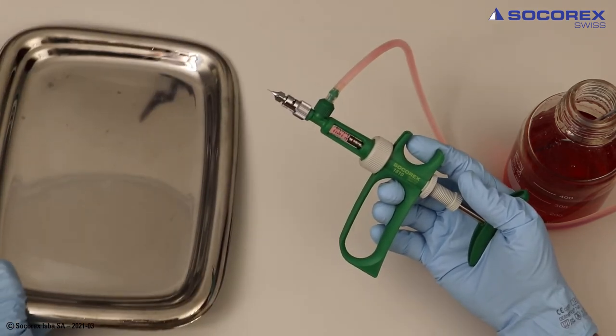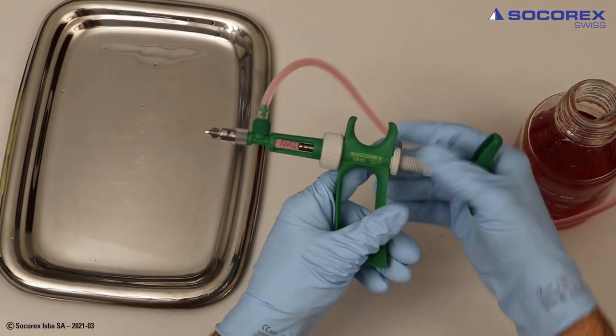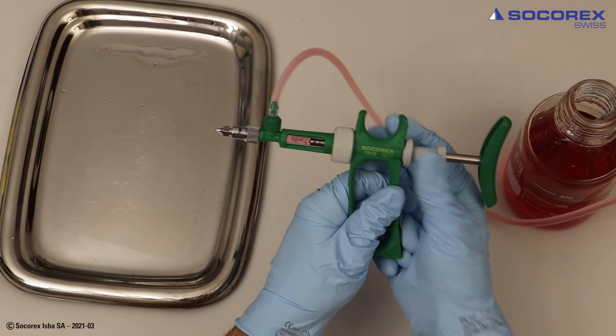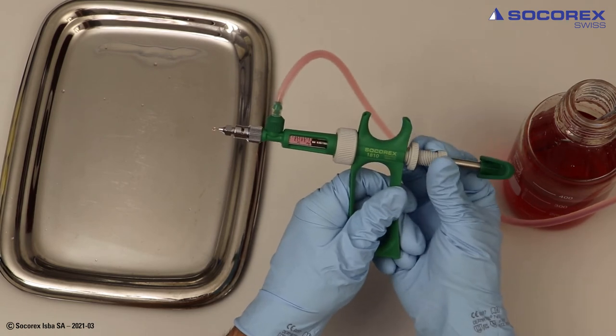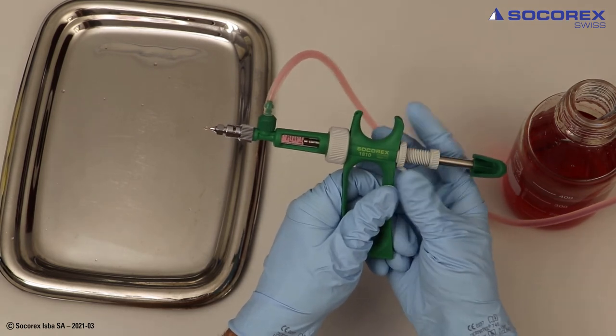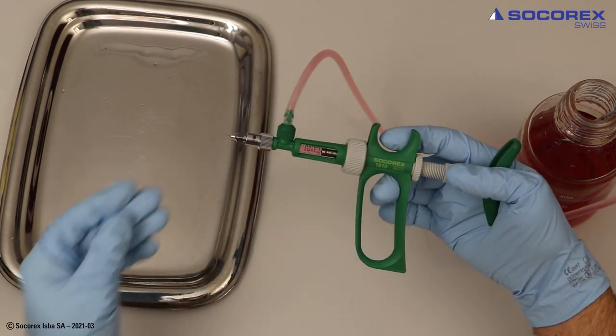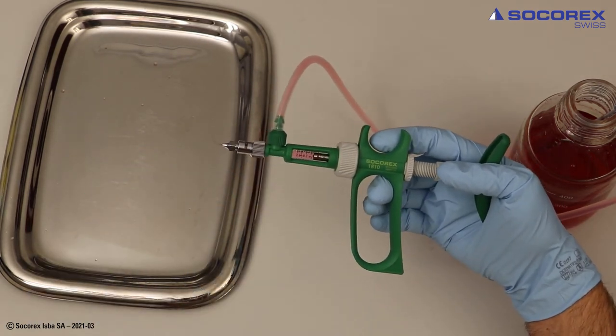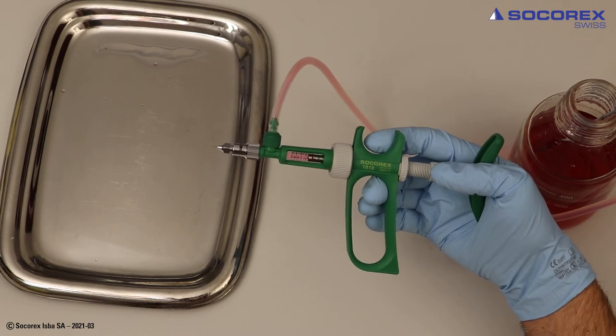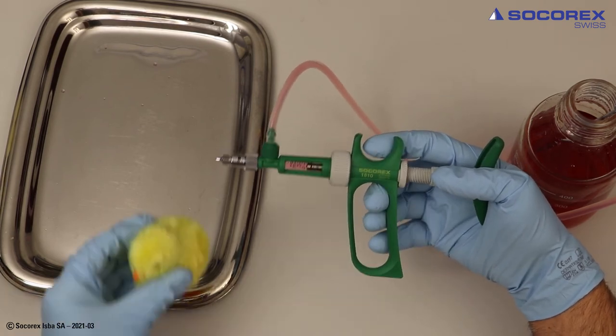Adjust volume after untightening locking nut and moving plunger up or down until wanted injection volume faces the red o-ring or the edge of the plunger on the 0.5 ml model. We are ready for injection.